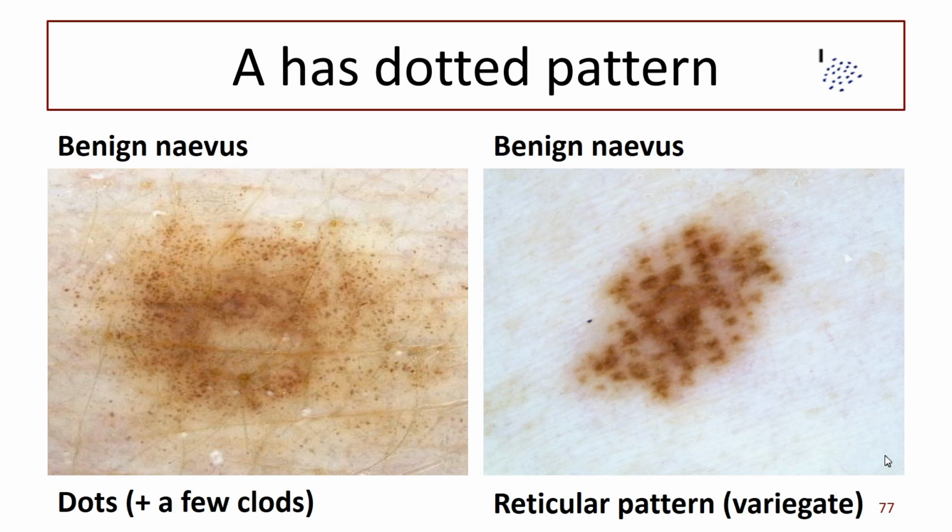And so what happens if you expose a nevus to the sun as it changes? We did a study of patients with psoriasis who were undergoing phototherapy. We imaged their nevi before they started phototherapy, during phototherapy, after they finished, and a few months later. We saw that 50% of the nevi exposed to narrowband UVB altered during treatment.